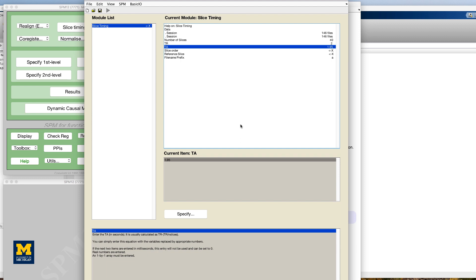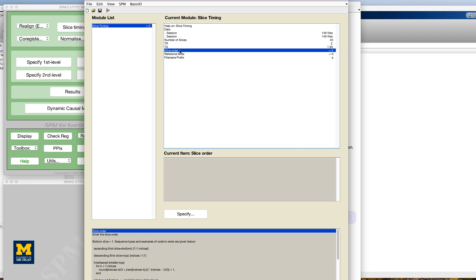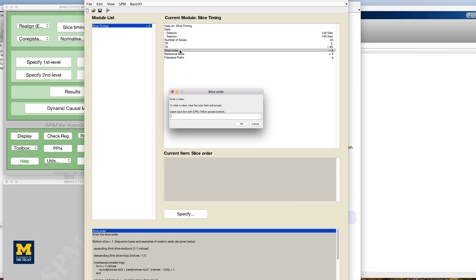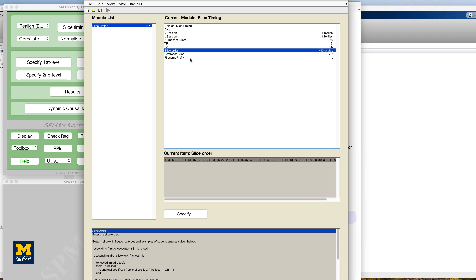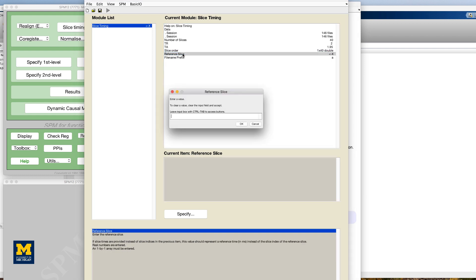For most data sets acquired with a Siemens scanner, the slice order will be ascending and interleaved. Enter this expression in the slice order field in brackets 1 colon 2 colon 40 space 2 colon 2 colon 40 and brackets. And for the reference slice, enter a value of 1 to indicate the first slice that is acquired.